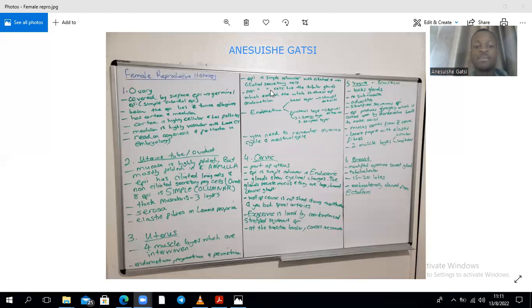Then, of course, there's the cervix. The cervix is part of the uterus, but histologically it differs in some aspects from the uterus. For example, the endometrium of the cervix is different from the rest of the endometrium that we find in the uterus. Right. The mucosa in the cervix is about 2 to 3 millimeters in thickness. And the glands that I find there are large, branched cervical glands. The glands show cyclical changes and they secrete mucus.